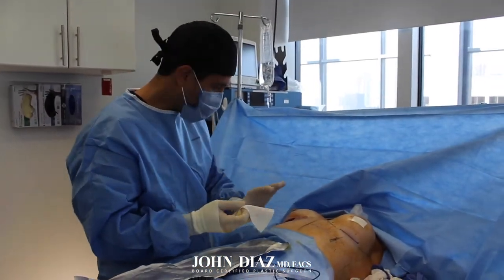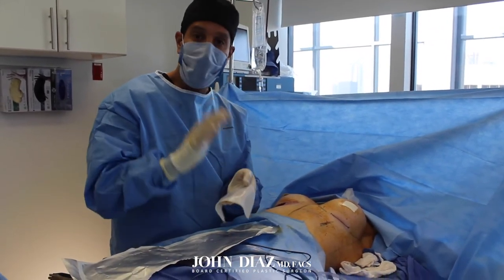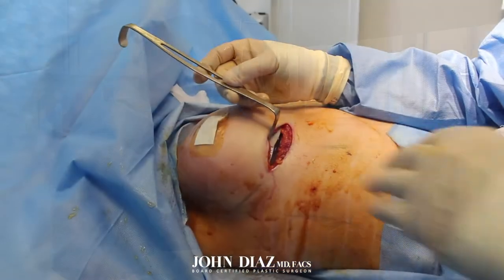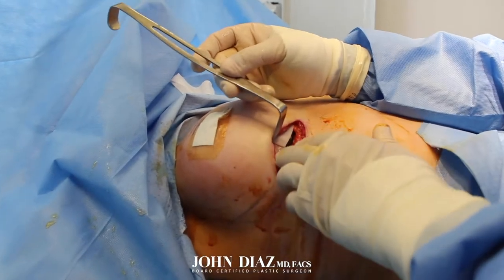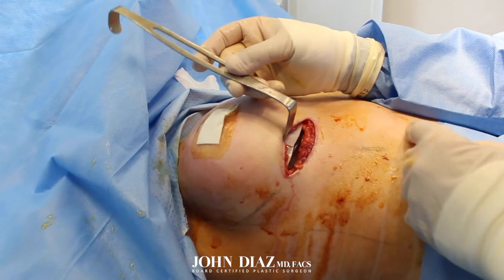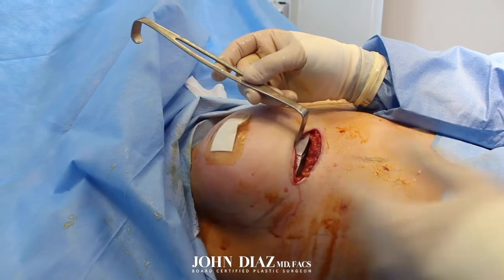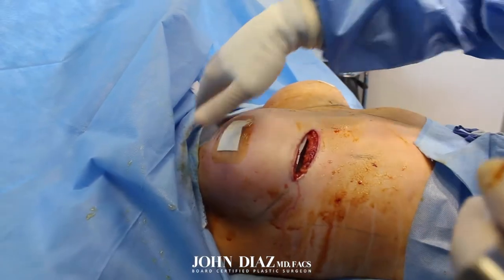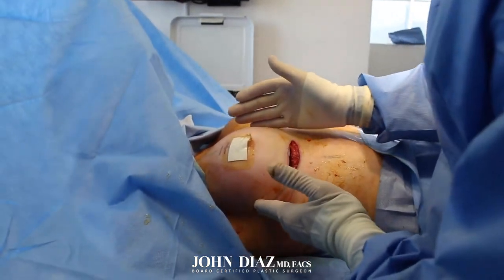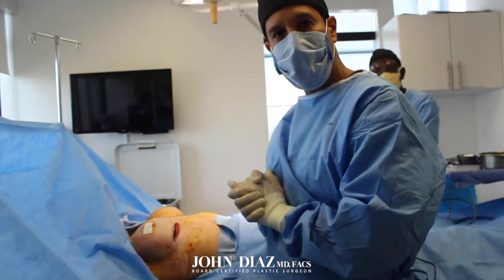Next I'm going to put this sheet inside the breast. This is going to wrap around the front of the implant and hopefully she will never have capsular contracture again. I've inserted the Strattice — I've cut a small line in it so that it folds better. The Strattice is completely covering the entire front of the implant, and as you can see the breast has a beautiful natural shape. When she's done, this is going to prevent her from ever getting capsular contracture again.